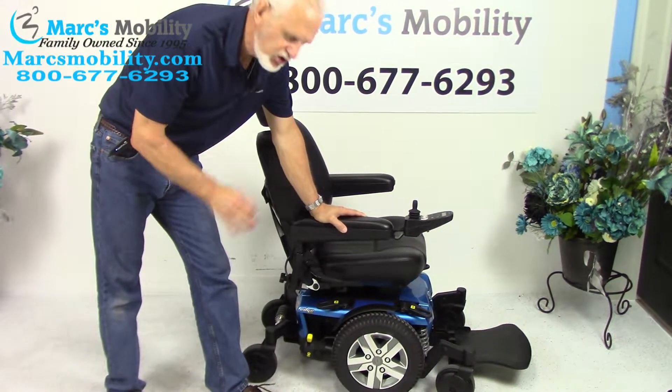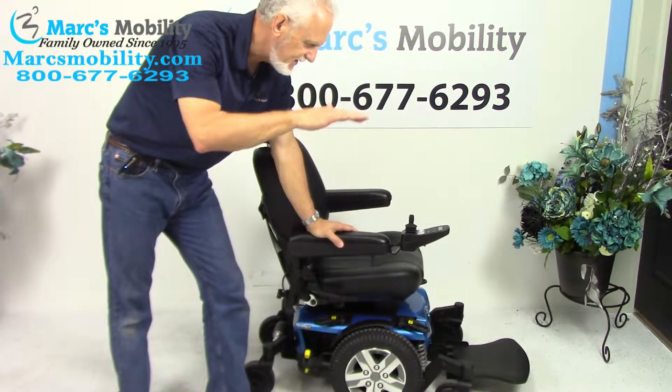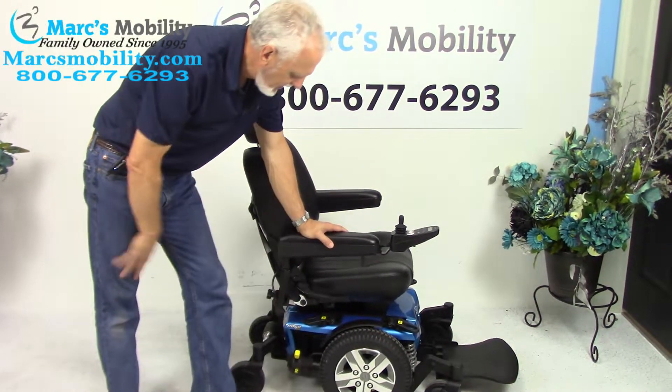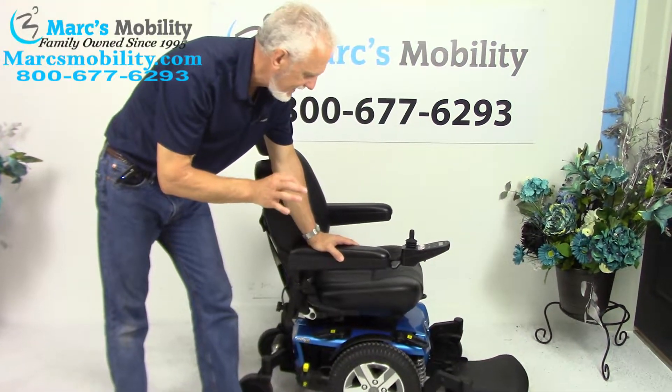This is a Quantum Edge 2.0 power chair with the 5 to 6 inch seat lift. Beautiful color, beautiful chair — sharp looking, classy chair.